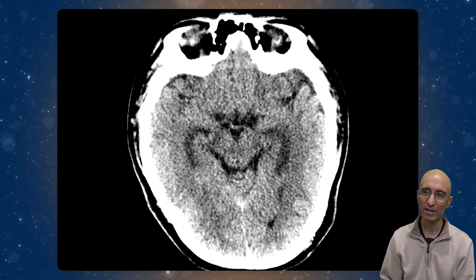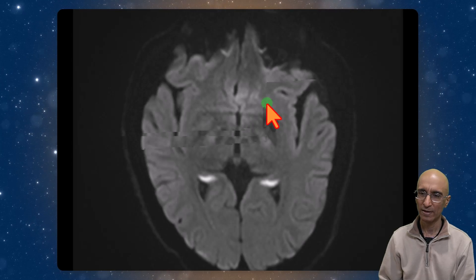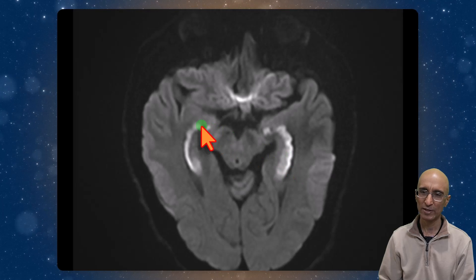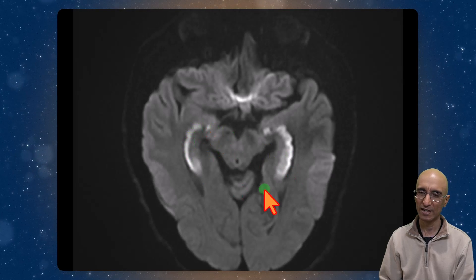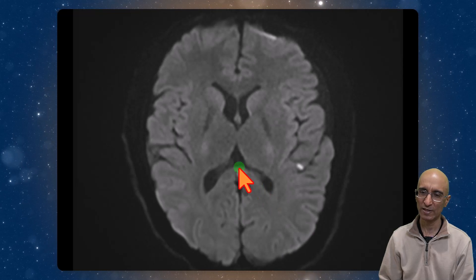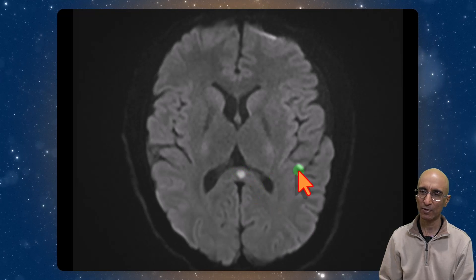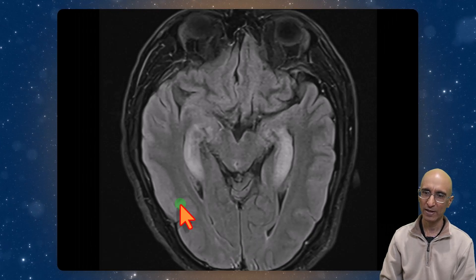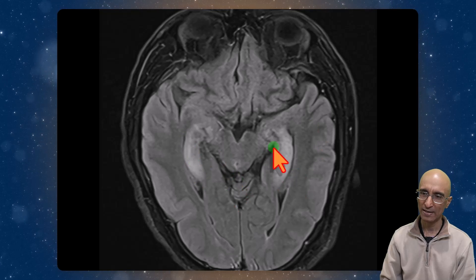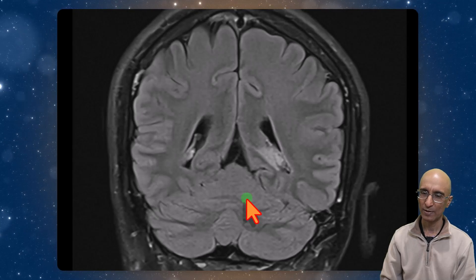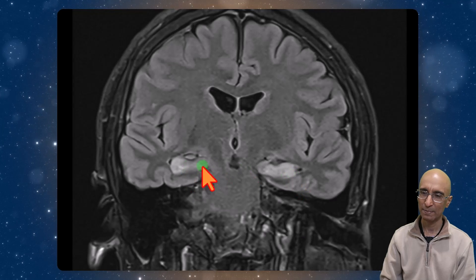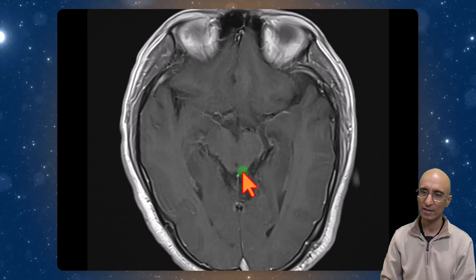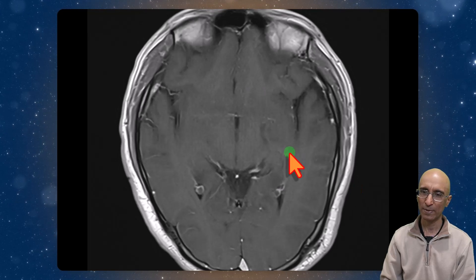I'm going to show you the MRI examination. On the MRI DWI sequences, we can see restricted diffusion in the bilateral hippocampi, which would explain the hypodensity seen on the CT head examination. The patient also had additional foci of restricted diffusion in the splenium of the corpus callosum and in the left temporal lobe. On the axial FLAIR images, we can see hyperintensity in bilateral hippocampi, and on the coronal FLAIR images, again we can see hyperintensity in bilateral hippocampi. There was no associated abnormal enhancement in the bilateral hippocampi.